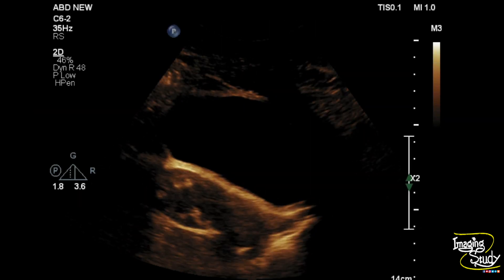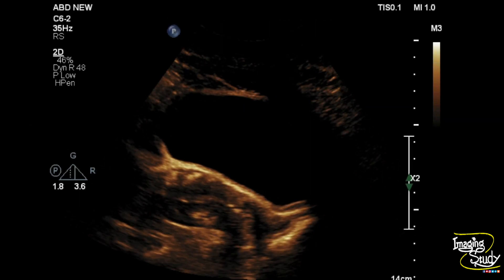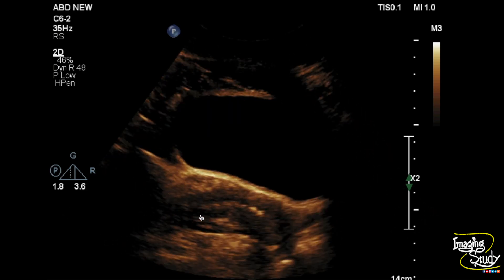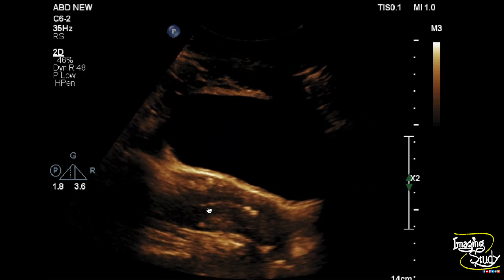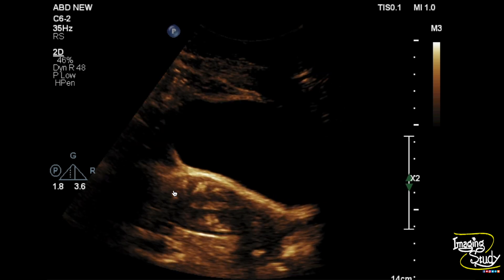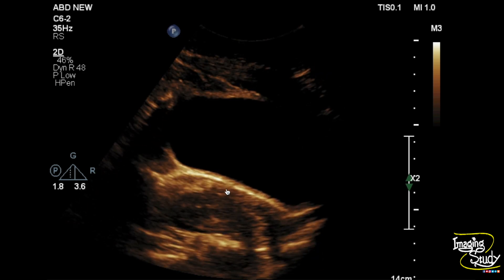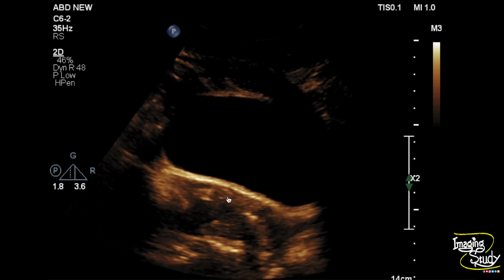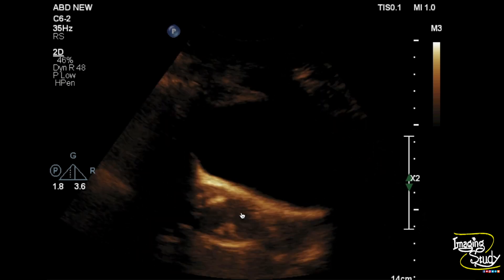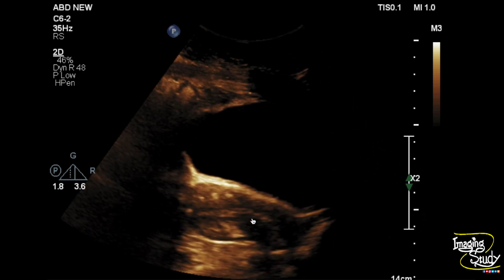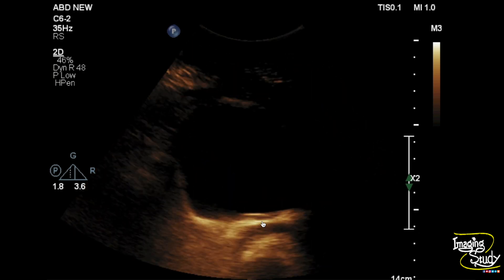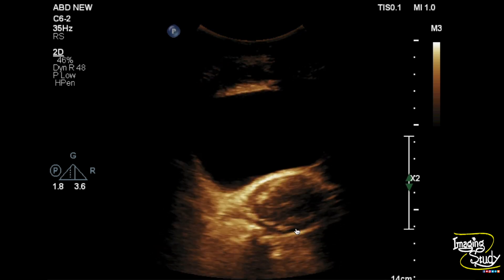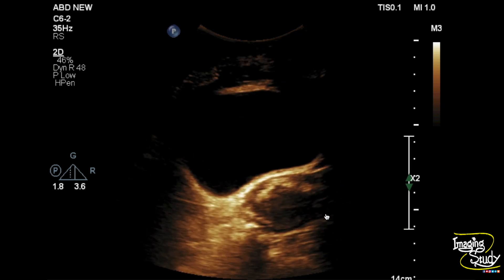Here you can see the longitudinal section of the uterus. You can see the endometrial lining here, which is going posteriorly, indicating it is a retroverted uterus. You can see multiple hyperechoic foci at the peripheral part of the myometrium, some casting posterior acoustic shadows. You can also see hyperechoic foci within the endometrial lining. These hyperechoic foci are calcifications.